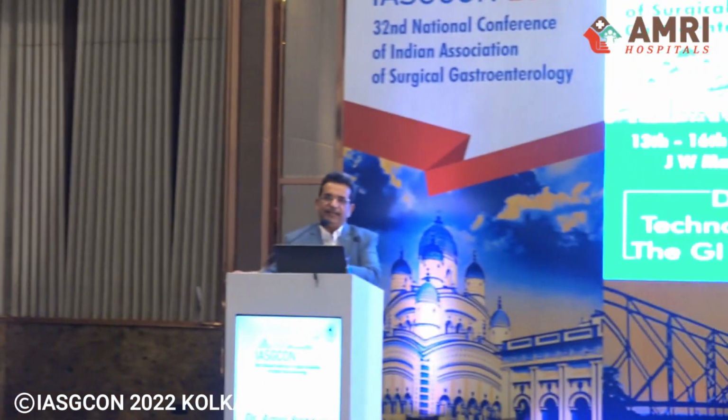Right. So the first question was about anesthesia, and obviously the time will change based on which procedure we're talking about. But most patients are done under propofol sedation. Some of the more complex ones like a gastrojejunostomy or hepatogastrostomy, sometimes these patients are under general anesthesia with intubation. But an FNA or an EUS guided fluid collection drainage typically would take not more than 10 to 15 minutes. A gastrojejunostomy can sometimes take longer, or a biliary drainage can take about 25-30 minutes on average.